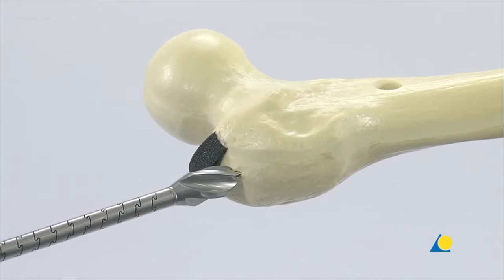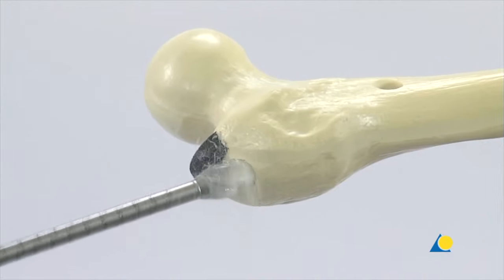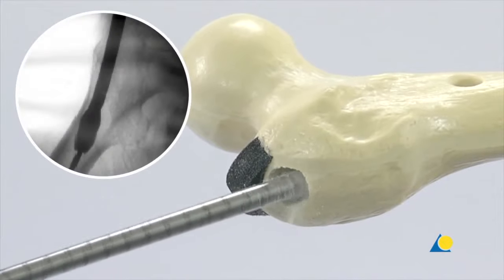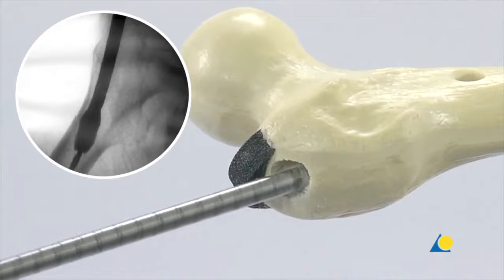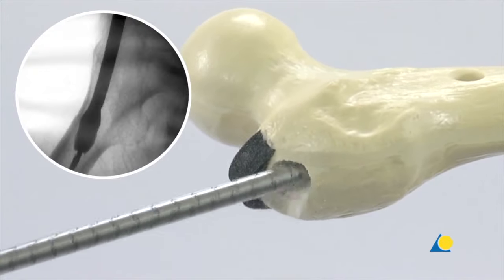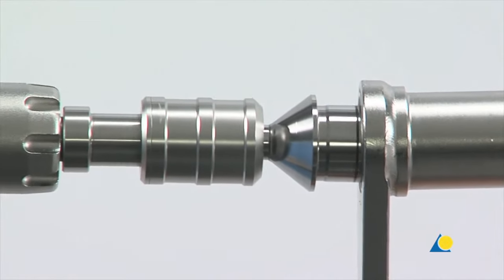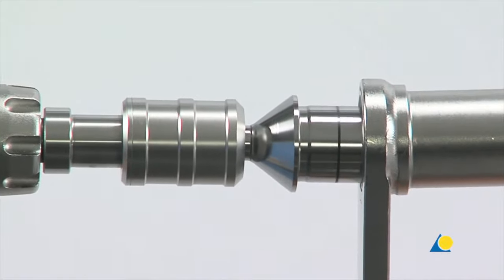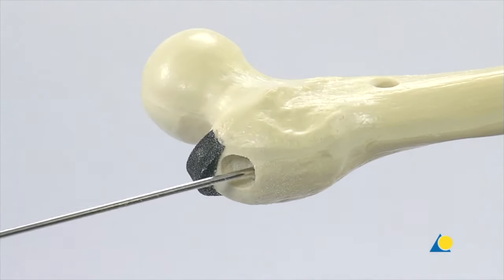Drilling is begun. While drilling, the drill bit is continuously moved back and forth to clear the debris from the medullary canal and to avoid jamming as the drill bit is advanced. Image intensifier control is used to avoid any unintended contact with the medial cortex. If it appears that the medial cortex will be impacted, the guide wire should be repositioned. The medullary canal is drilled until the stop on the drill bit reaches the protection sleeve. The drill bit, the protection sleeve and the guide wire are removed.